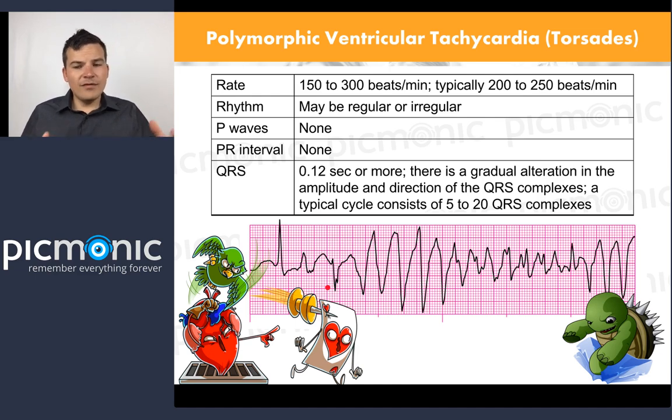Now, you could have a short paroxysmal bout, but remember what we know about anything that's paroxysmal? You need to be worried about it. So these patients usually have an impending cardiac arrest, well, this is cardiac arrest, but it doesn't go well after this. So we need to make sure we're worried about these.